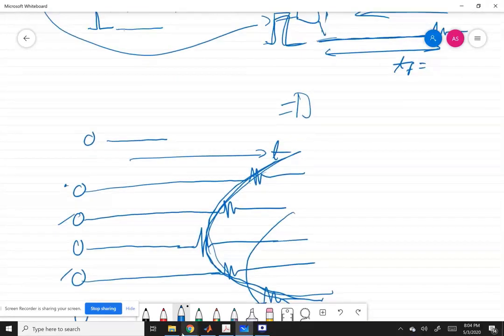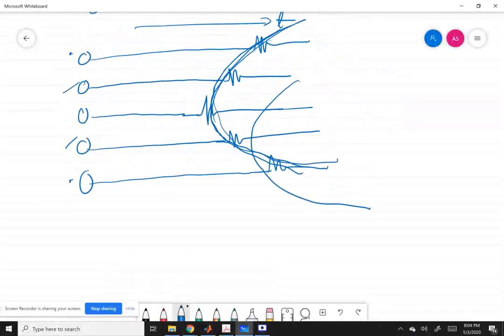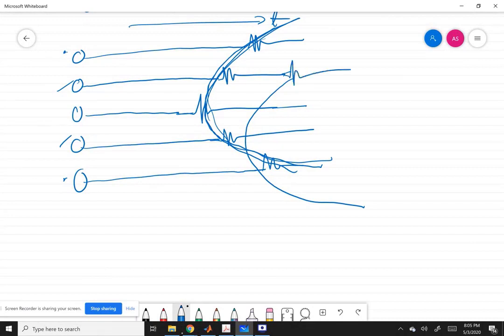If you have multiple points, or there is a complex object in the field, then the radio frequency signal which you will receive will be pretty complex. And the aim is to combine all these signals so as to reconstruct this bow type of signal into a single point.